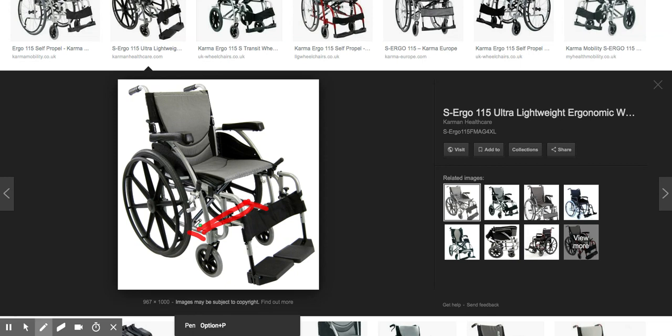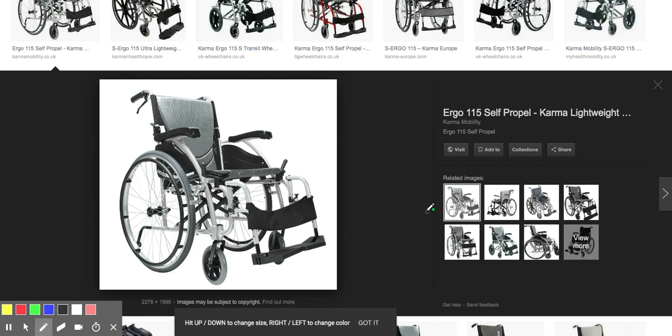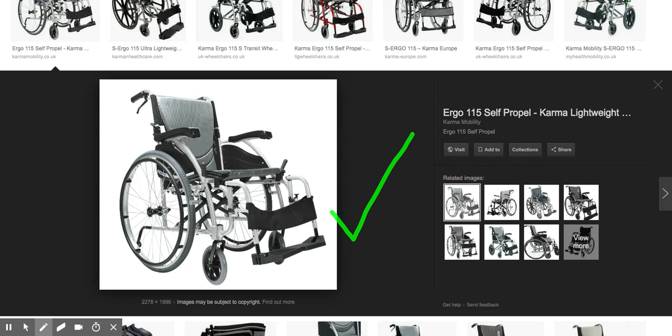You need a minimum of 2.5 inches of parallel horizontal bar in order for the freewheel to fit. If you've got this type of chair — the Karma Ergo 115 — then the freewheel will fit with the folding adapter perfectly. You can go ahead and arrange a trial from ourselves at Invictus Active. Thank you.